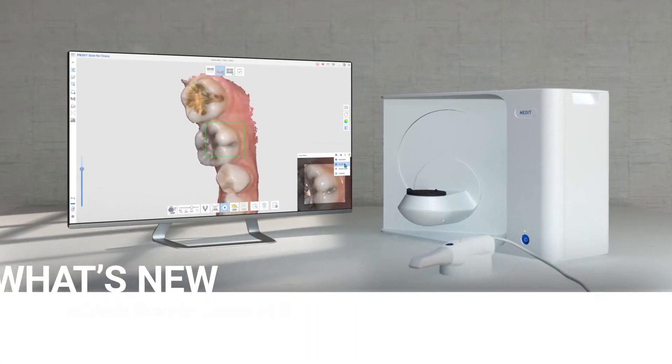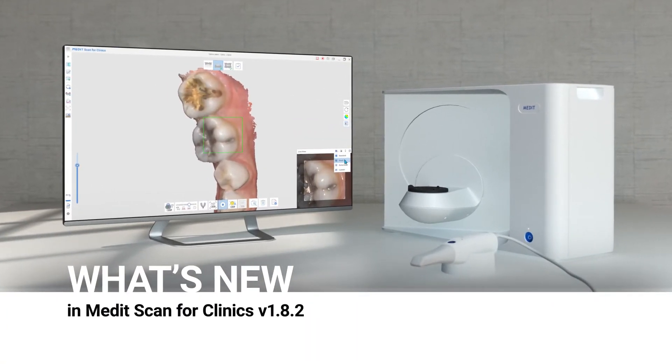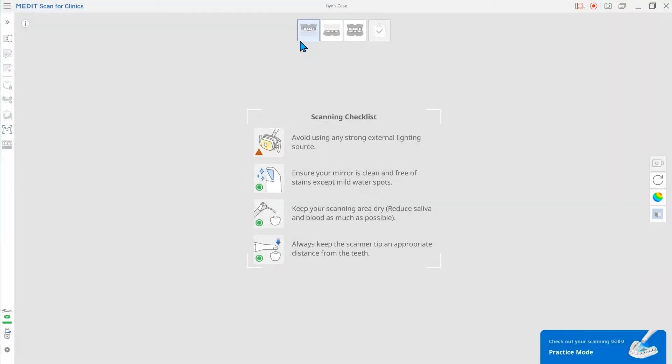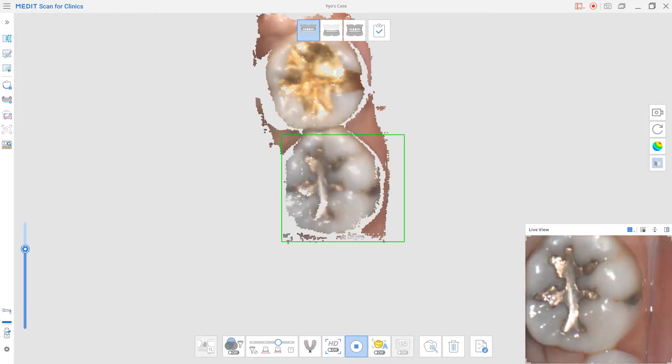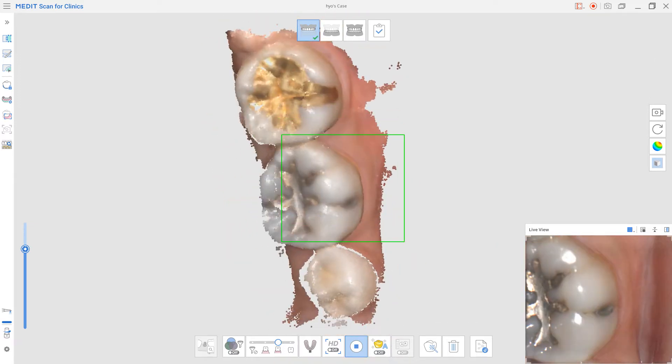We'd like to introduce to you the updated version of Medit Scan for Clinics. The biggest update of this version is a new feature, the scan area, which lets you adjust the range of the scanning area.